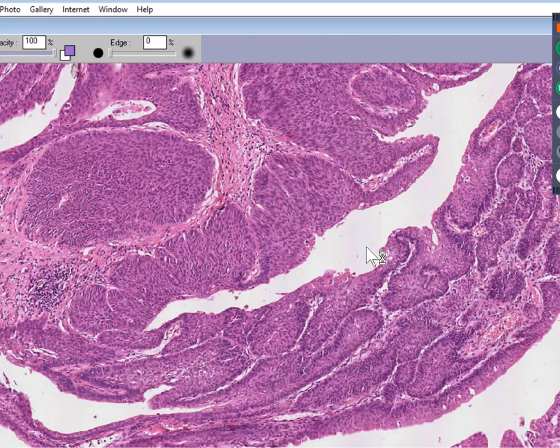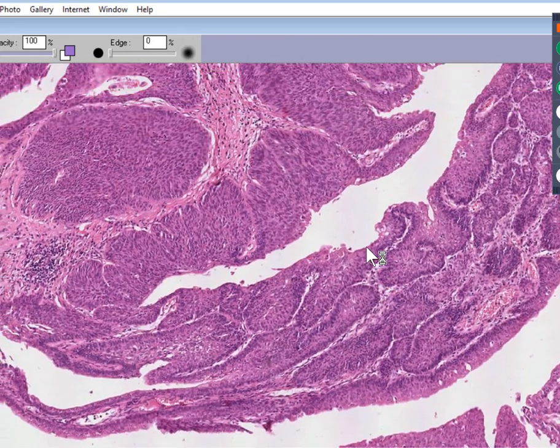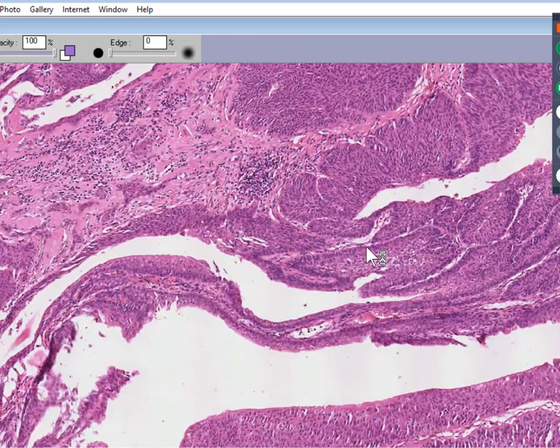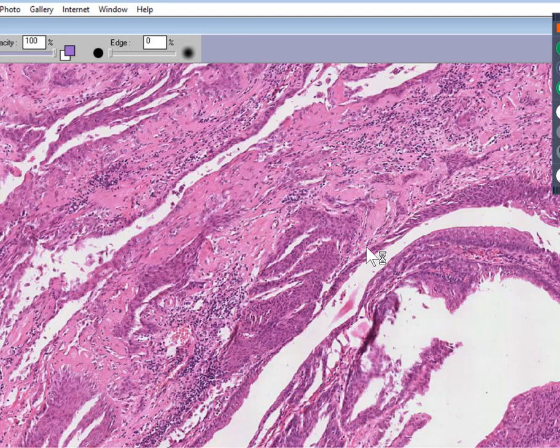See, there's a little papilla there. There's a little finger. Sometimes the fingers are so compressed, so close together, you can't realize it looks like fingers because the fingers look like they're closed. But look, there's a nice little finger. This is a papillary urothelial or papillary transitional carcinoma of urothelium. Actually, if you are a histology fan, there are a couple other tiny areas of the body that have transitional epithelium, but for all practical purposes, transitional epithelium can be called urothelium as well.